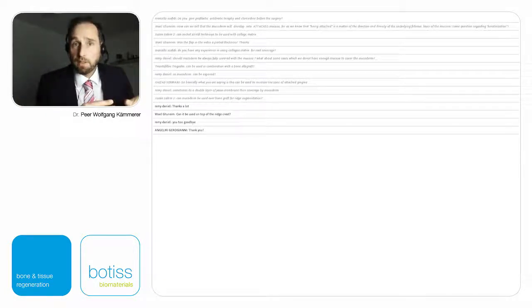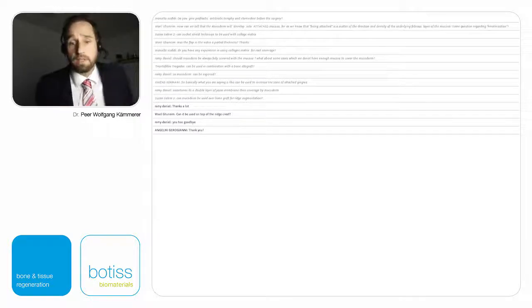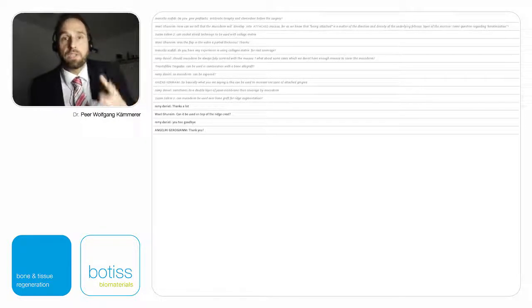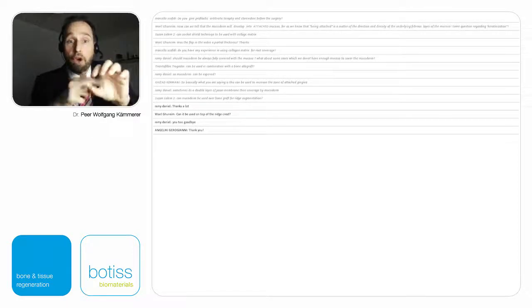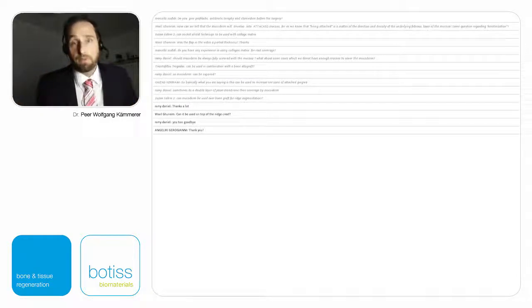In these cases, if you talk about increasing, it can be exposed. Yes, of course. In all of these cases, in these 20 cases, it will be exposed in all cases. That's why I said it's a protection. It's also exposed in these socket shield techniques. You just put the exposed mucoderm on the hole in the alveolus. You just put it there, and it works. It can be exposed.